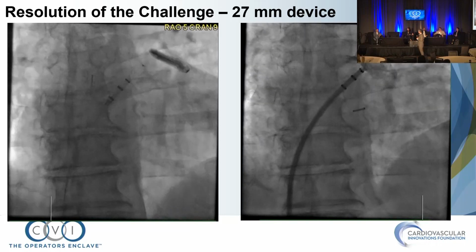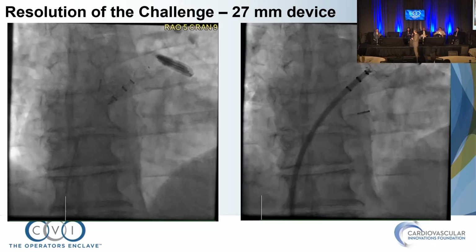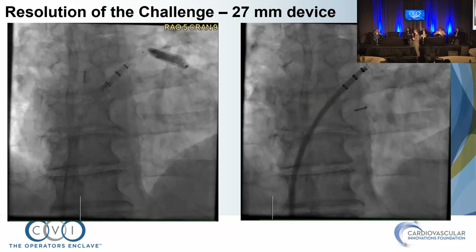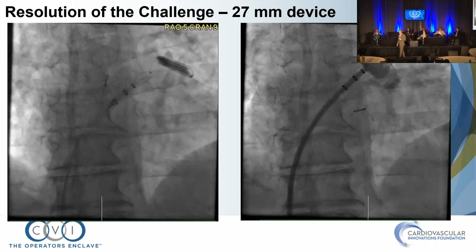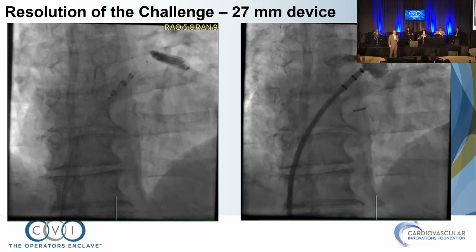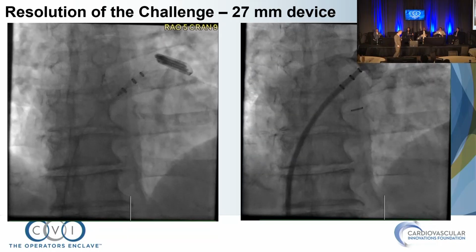One crazy idea is you could try to wire the atrial clip. Get a wire in between the two arms of the atrial clip, and then maybe try to access, because there is residual appendage back there. If you could get a catheter and put a basket plug, and put the disc behind the atrial clip or something like that, I think that'd be tough. But just thinking outside the box.